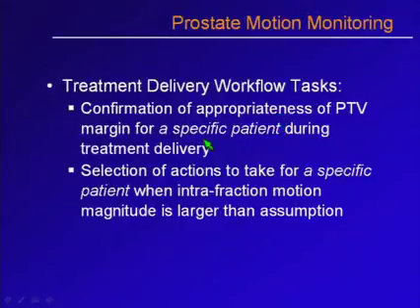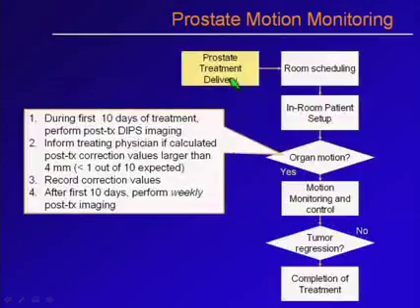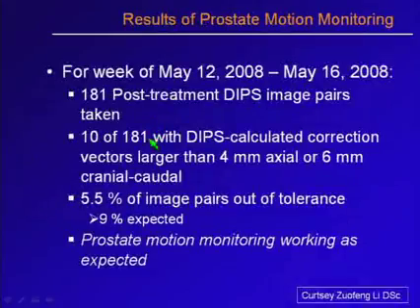So we went through looking at this prostate motion study. And this is what we did. This goes back 2 years ago, where prostate treatment delivery, scheduling the patient in the room, in-room patient setup, organ motion, yes, motion monitoring, no, tumor regression, all that. So we monitored that during the first 10 days of treatment and performed an in-depth analysis of all of the imaging to determine whether we fall into that criteria of acceptability that we have established.